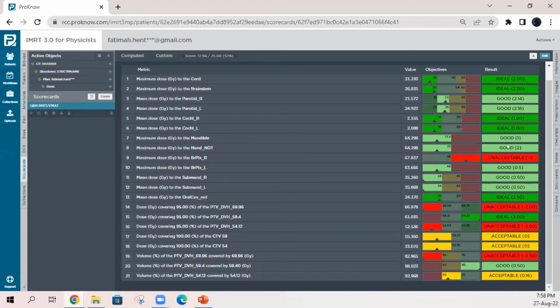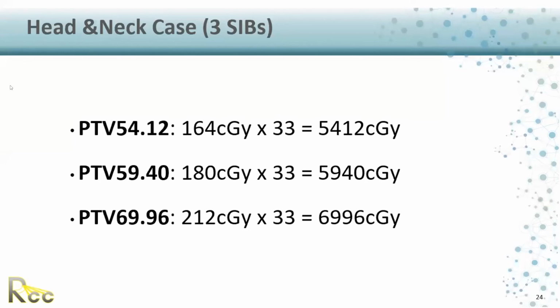So what we prescribe to the high risk volume, this is what we did in the presentation. Can you please stop the sharing of my screen? Excellent. Okay. There you go. So just a second. You can see my screen, right? Right now we don't see your screen. Okay, I need to share. Right, you're right. I have three screens. I hate it anyways. Now you see, right? Yeah, there we can see it.